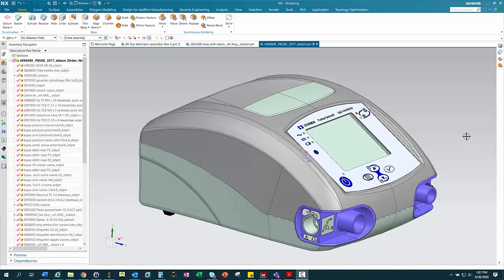Okay, for the next part of our journey, we're going to show how to create the part using additive manufacturing. So we identified the part in the assembly that we're going to change. Now this is going to be a totally new part. It's going to go from 6 pieces to 1 piece. We're going to change the airflow because potentially, with 3D printing, we can curve things and make things that you couldn't make with conventional tooling. And then we will end up doing some analysis to make sure it's a good part, and we will put it in the print tray.